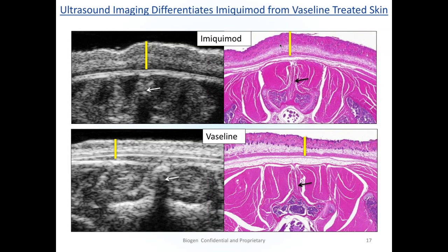So we had to be, as I was saying before, very aware of the hair removal cycles and how to schedule our ultrasound imaging around that. We obviously wanted to minimize the hair removal as much as possible, so we wouldn't want repeated cycles. But we were aware, because of what's been documented and published, that certainly 3 weeks after a major hair removal, there's a huge proliferation of new hair follicles and abundant hair growth.